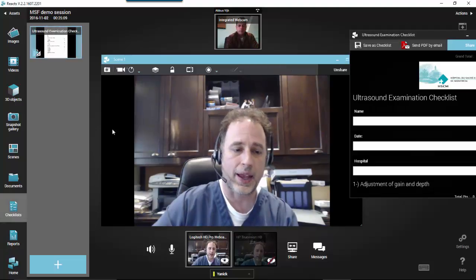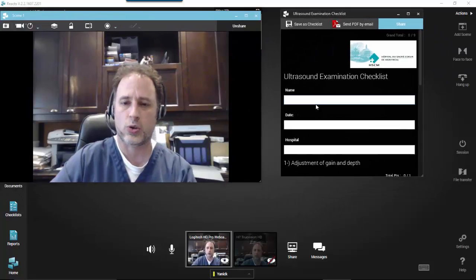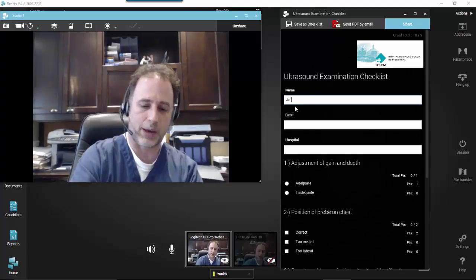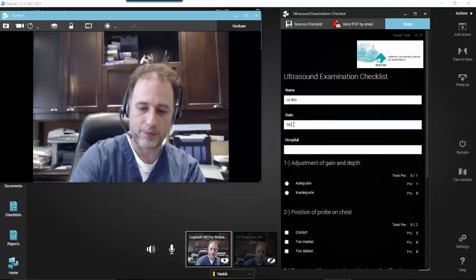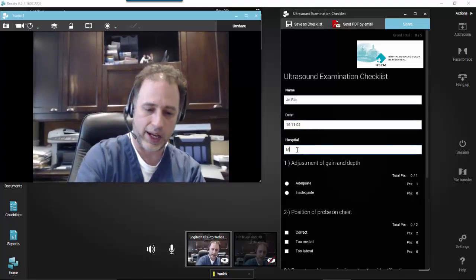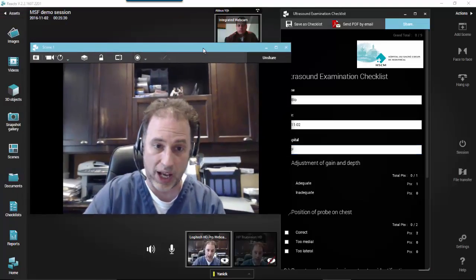And then you can see here, I'm just going to move that scene. So here's the checklist. So ultrasound examination checklist, I can make it bigger. So the name, so let's say I'm examining Joe Blow. The date is November 2nd. The hospital is, let's say, MSF. And now I'm starting. So I could be looking at the live ultrasound feed.